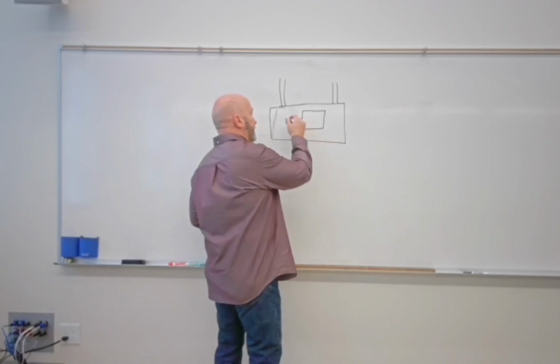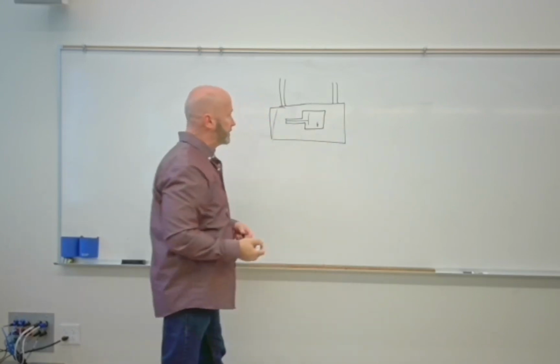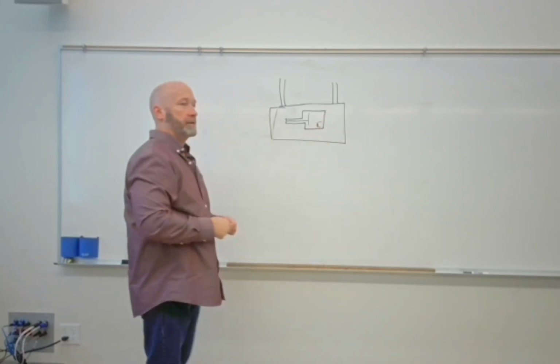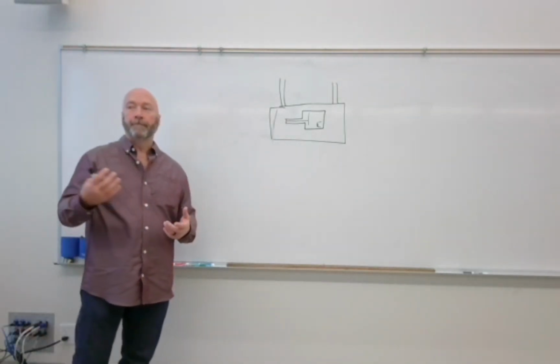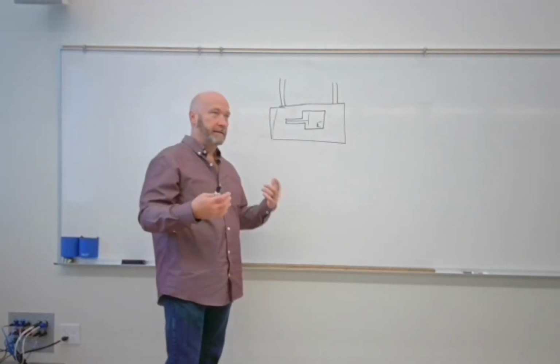So inside of the X-ray tube, we've got the cathode and we've got the anode. The cathode is the negative side, the anode is the positive side. The cathode is just a filament, and we're going to run a current through the filament until we get to a point where we're boiling off electrons, and that is what we refer to as thermionic emission. Thermionic creates hot ions, right?